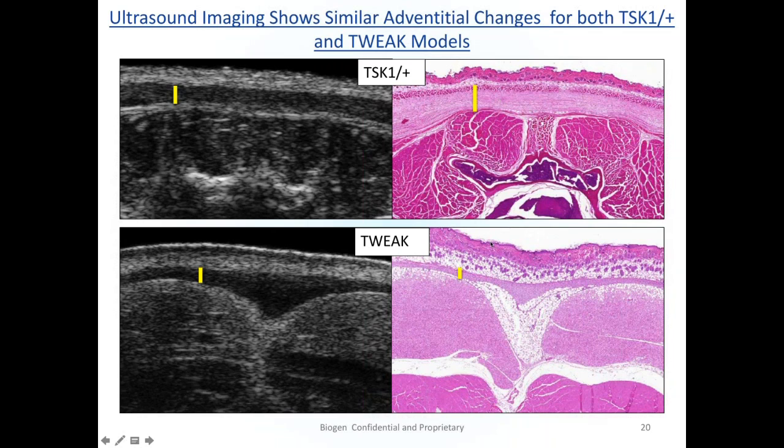Looking at this level of an H&E image, it looks like it's some connective tissue and possibly some cellularity, and we consulted with our pathologists and weren't completely sure what to make of this. So we did a little bit more of a dive trying to understand how similar these two newly developed layers were, and how they were giving us a similar appearance in the ultrasound.